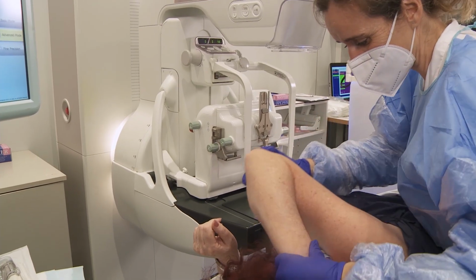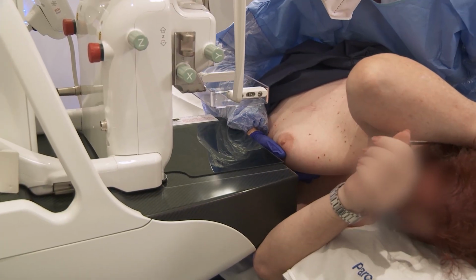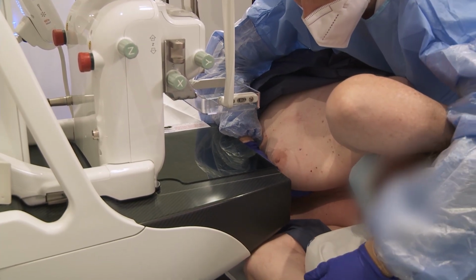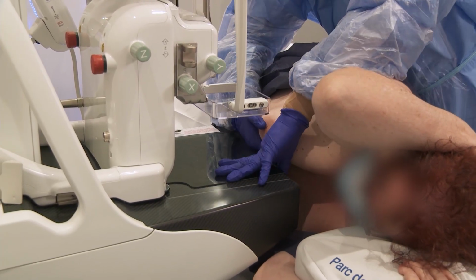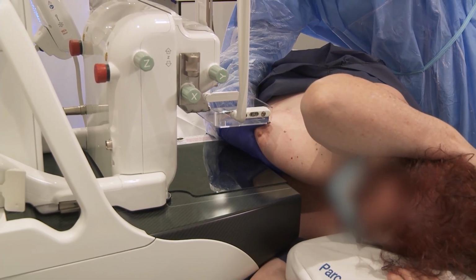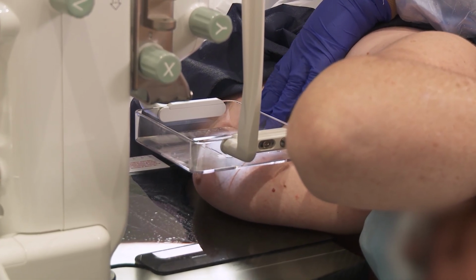While positioning, special attention should be paid to patient comfort. Adequate breast compression is applied.